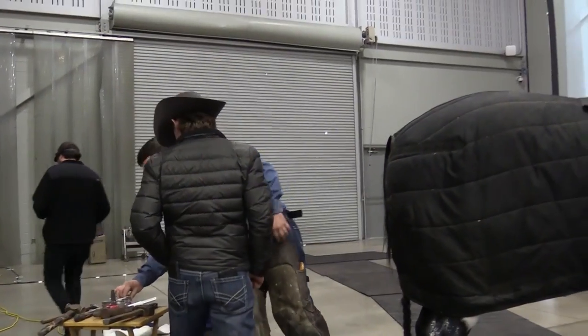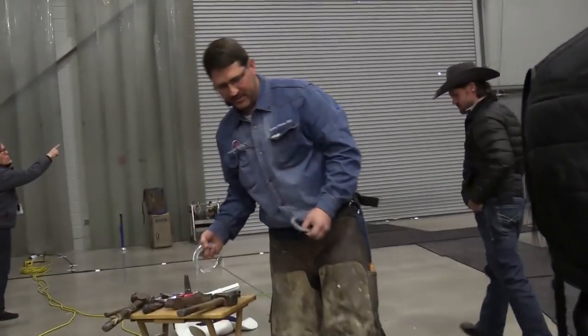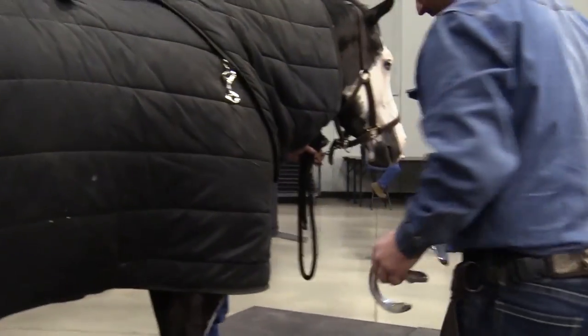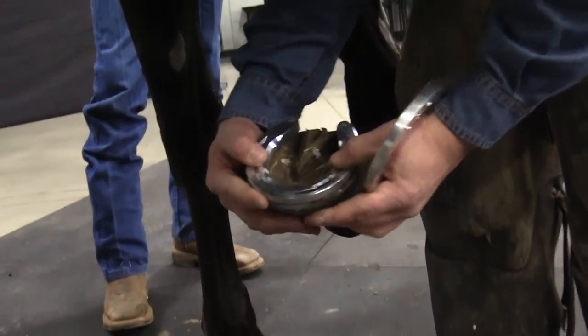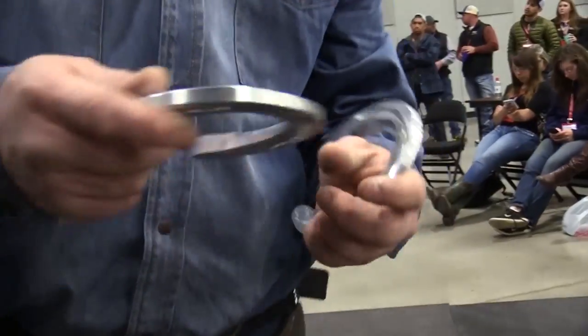All right, so for this case, I would identify this as a low-end mechanical need, but I still want to be more than just a flat shoe, because I don't have a whole lot of foot mass, and I think I can jumpstart this foot with just a little bit of mechanics. And like I said, I like these KB aluminums because it's just kind of a nice blank slate. I can put a lot of different modifications in this and then add a little rocker to it and be a low-level mechanical advantage.